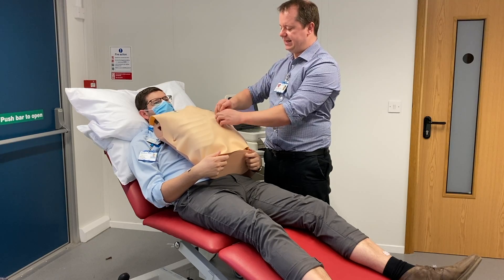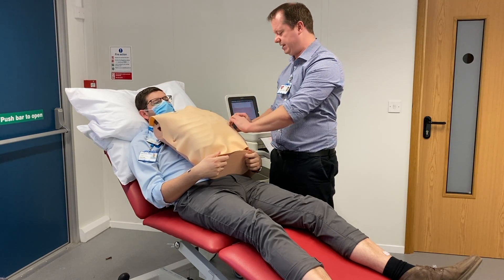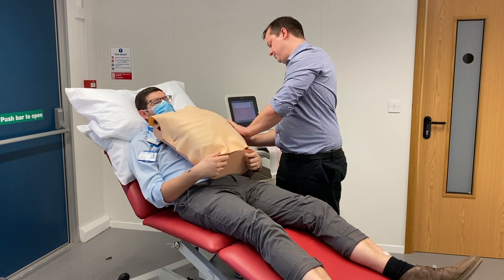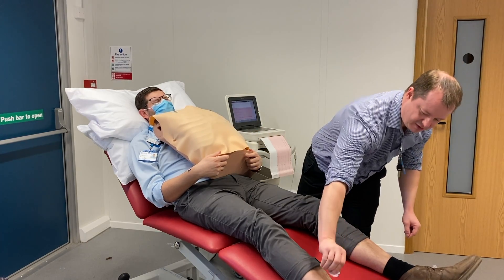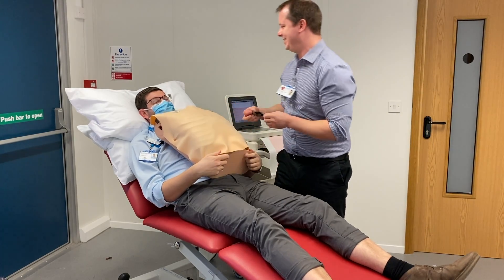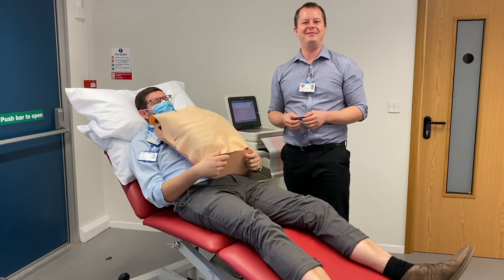It's very lazy to leave the tabs on. If you are going to leave the tabs on it has to be for a very specific reason - if you don't have a specific reason, you're just being lazy and we don't want that. So always take the tabs off. And that's how you perform a 12-lead ECG - thank you very much.